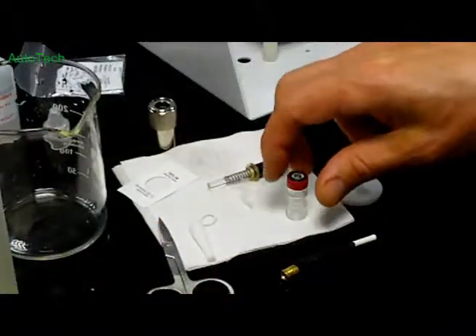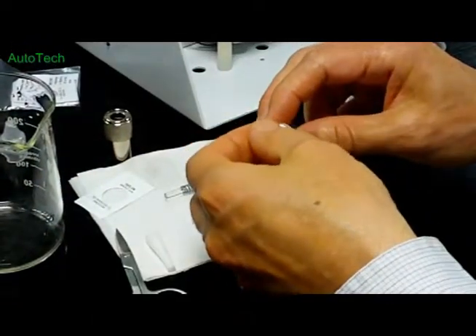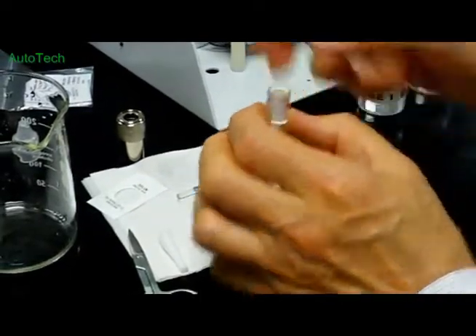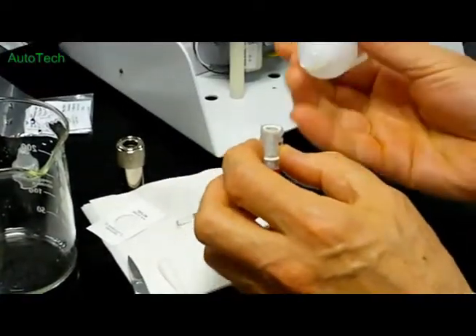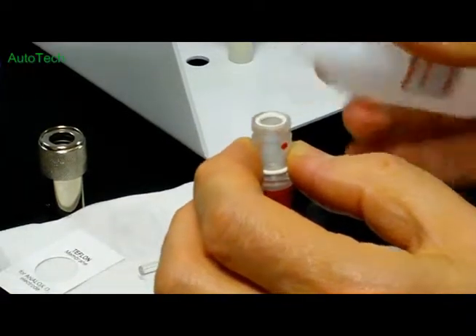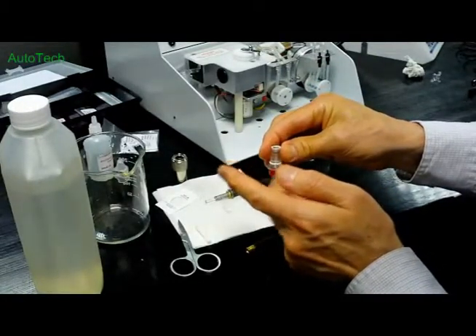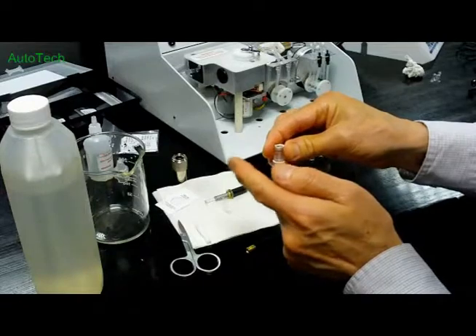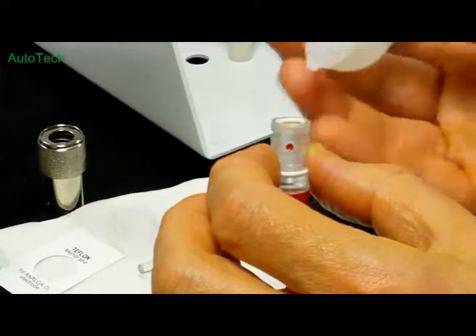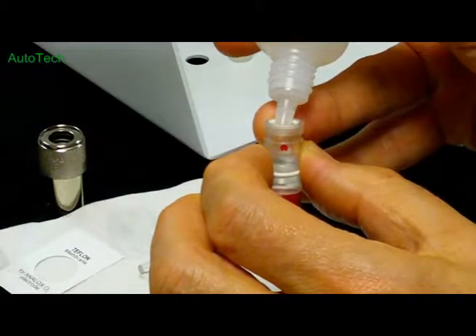So the first thing to do now is to make sure you put the body O-ring back in the base of the jacket. It's very important to do this at this stage. And now we're going to just put a few drops of electrolyte into the jacket. And then gently tap the body of the electrode to displace any air that might be trapped. And now we'll continue filling the jacket with electrolyte up to the level of the red dot.